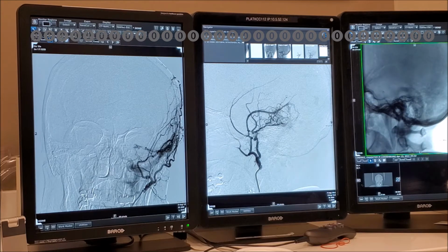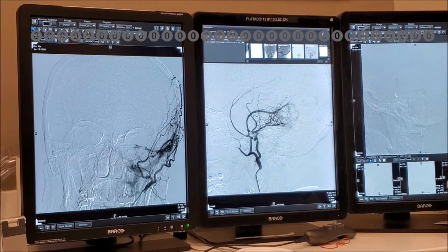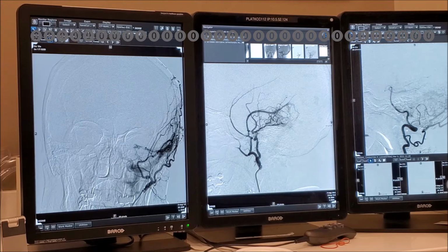Something peculiar. Okay, fantastic. What is this thing? C2 segmental artery. And what is it opacifying? The occipital artery. Correct. You see it perfectly, the anastomosis, right? What is this one here? The odontoid? Ah, gotcha. Oh no, sorry, remember what we said? It projects posterior, to the vert. Sorry, okay. You'll see.